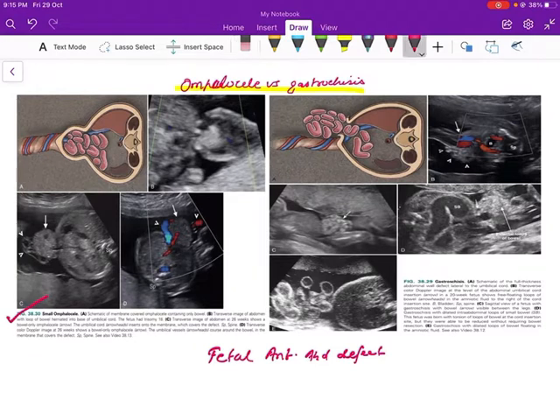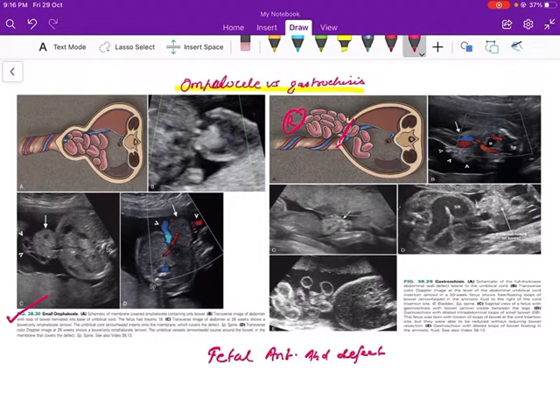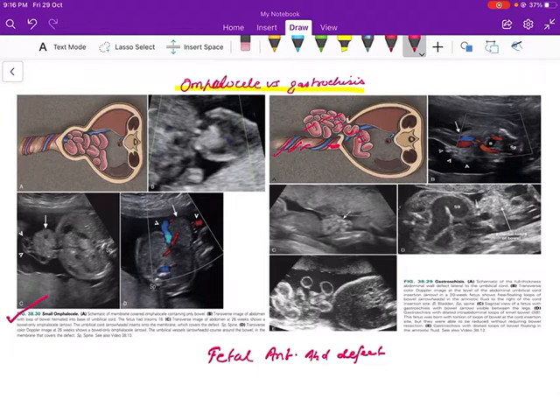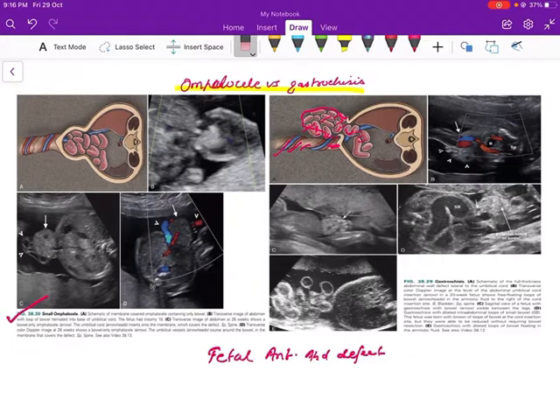Next is gastroschisis, where the defect is not in the midline but in the para-umbilical region, usually on the right side. The defect is in the right para-umbilical region, through which small bowel loops are seen herniating. The insertion of the cord is at its normal location in the umbilical region. The herniated bowel loops are not covered by any membrane — they are freely floating in the amniotic fluid.